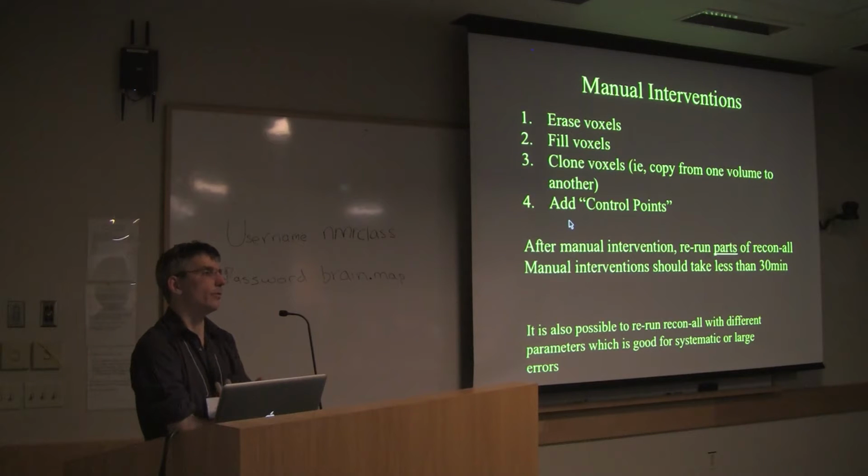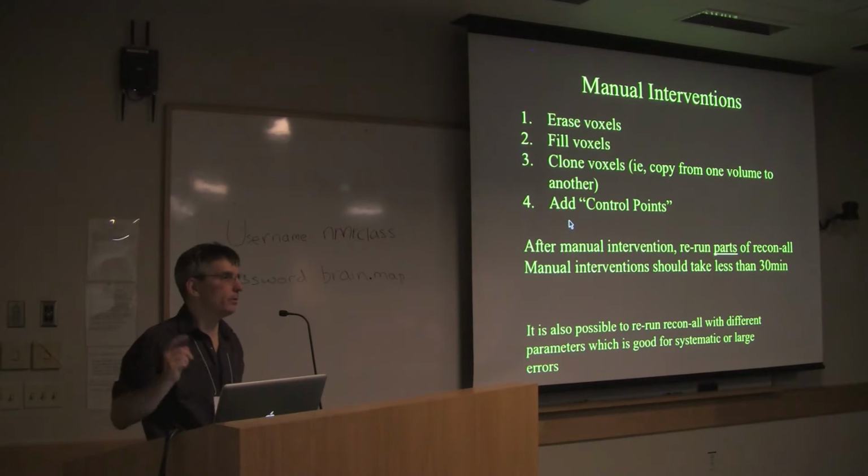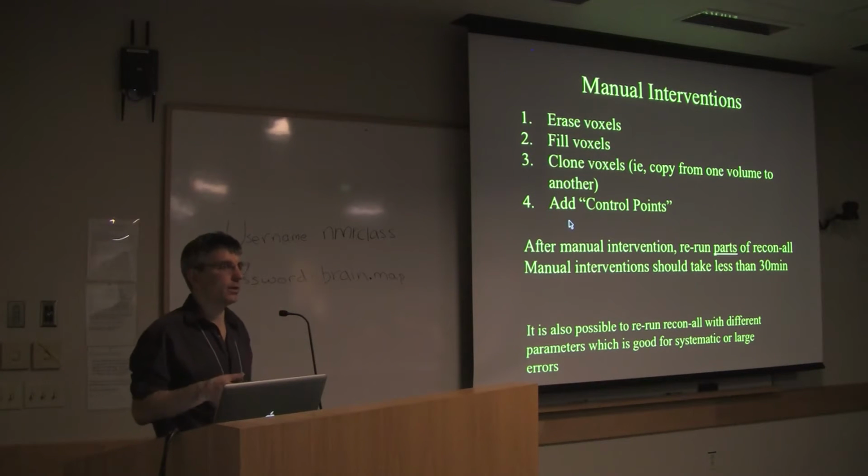So I want to throw that out there to give you a sense that there are boundaries and limits on this. And most of the time, if you can't quite decide whether the surface is accurate or not, leave it alone. In general, you don't want to edit too much. Most of the time, FreeSurfer is going to do the right thing. And if you get in there and start messing with it, then you might actually break something.